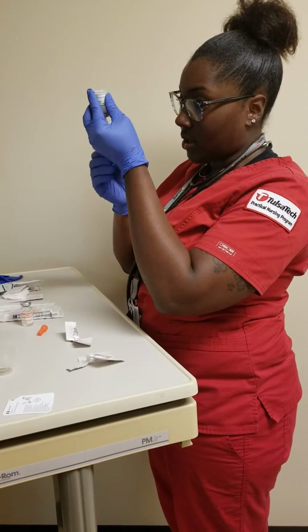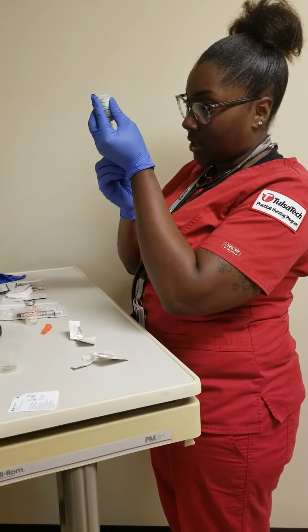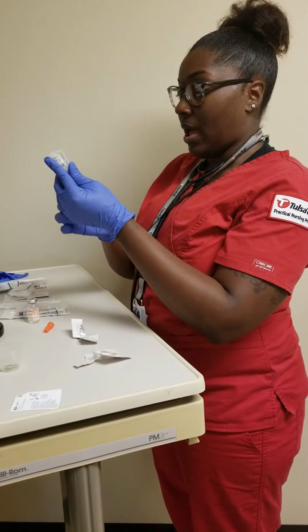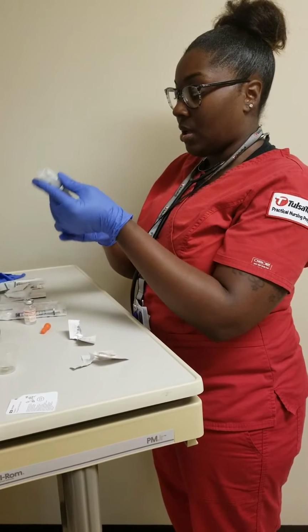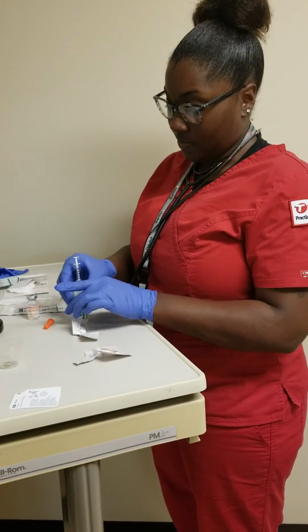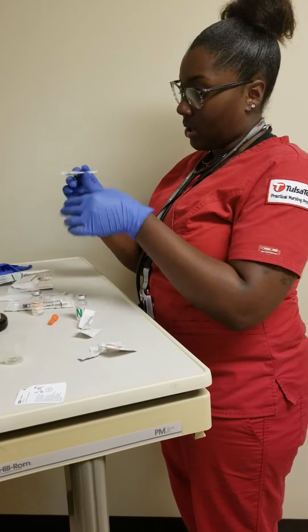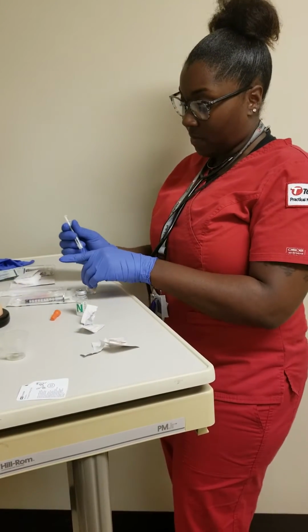And also with insulin, I would have another nurse come in and verify that everything's correct as well. So I have 5 of the NPH. Take that out. I would get the other 5 of my regular insulin.